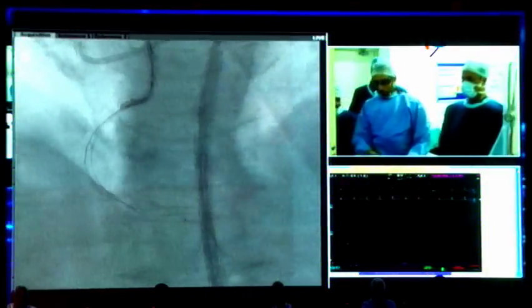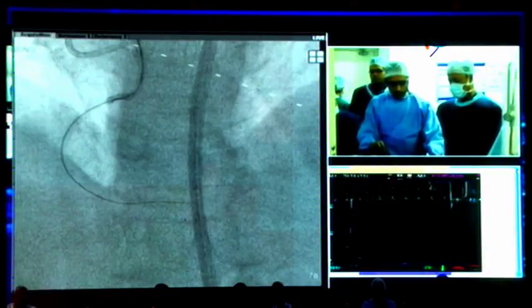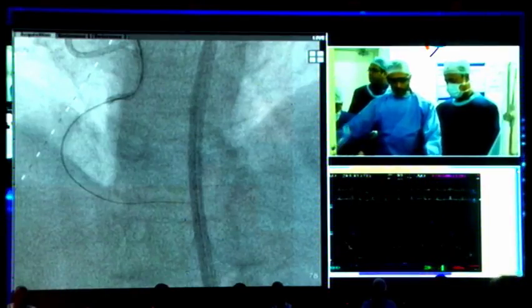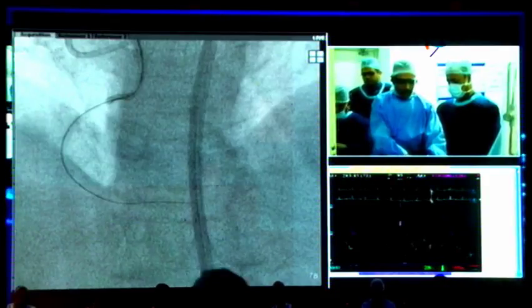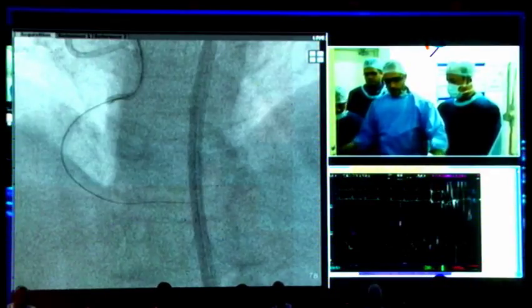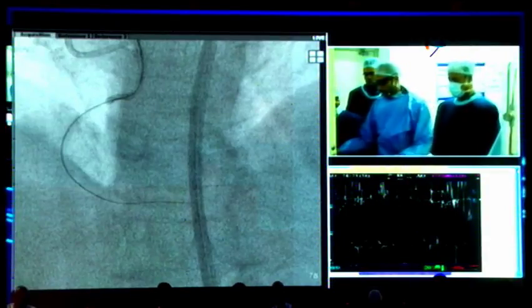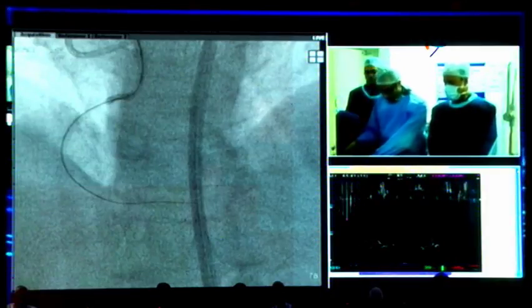Okay, guys, hold on one second. No, don't give. We have a trap balloon. I've got to get the air out, okay? Just be careful. It's all good. Let's take it out. Trap balloon, if it is deflated, no problem. If it is inflated, no problem. We just have to bleed back. We didn't want to inject because there's probably air. It's all good, guys. You're good. Thank you.